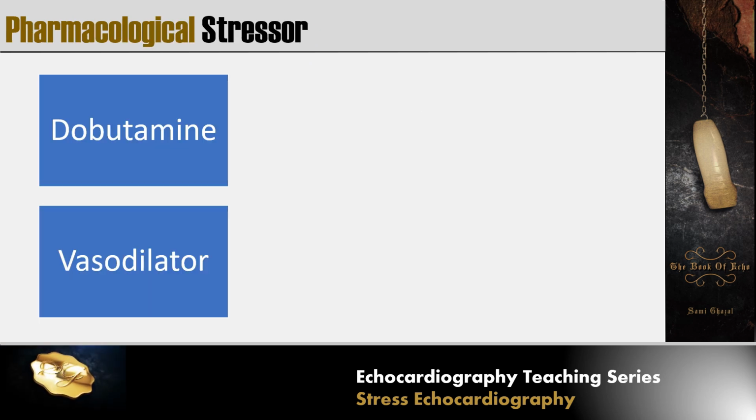For the pharmacological stressor, the main stressor being used is Dobutamine. However, for vasodilators, they are still used, but with less frequency.